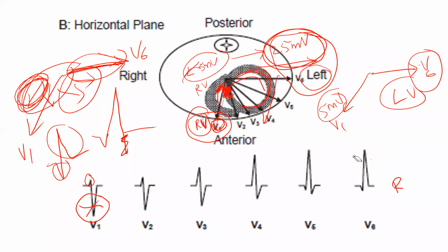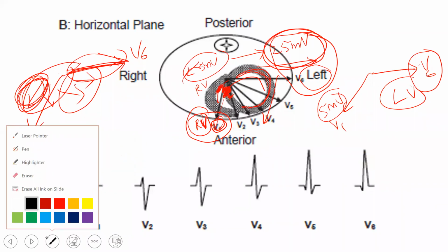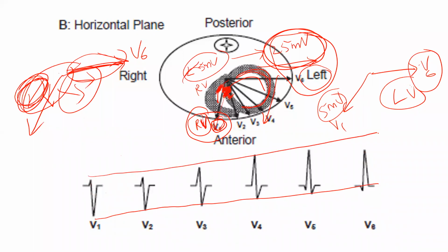But one more way you can understand this is the main concept we have here. Why I told all this is, in one more way I'll try to explain to you. This is the one wave which you are going to see here, going upward like this. Waves are transforming from negative wave to becoming predominantly a positive wave. So why is this happening?